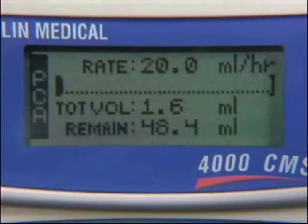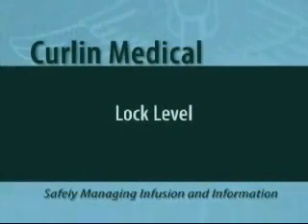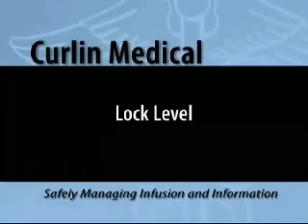If a clinician dose is to be stopped, use Pause, edit to 0, and restart. If a lock level is programmed, it will ask for a code. Use the lock code you entered for security purposes in order to program the clinician dose.